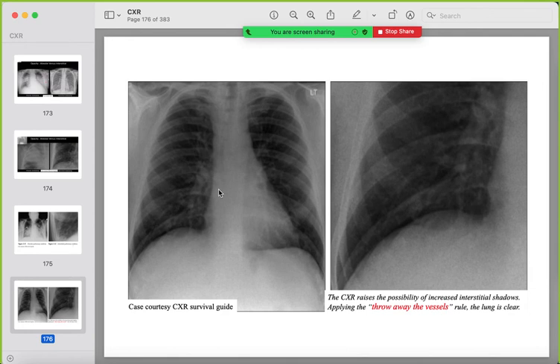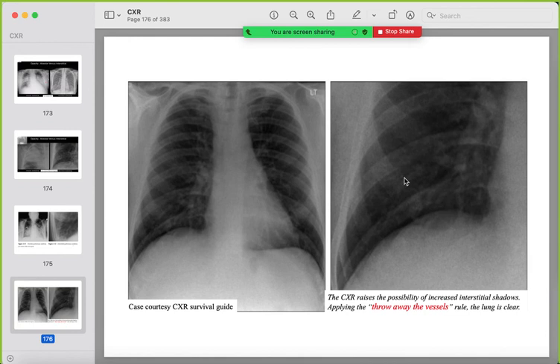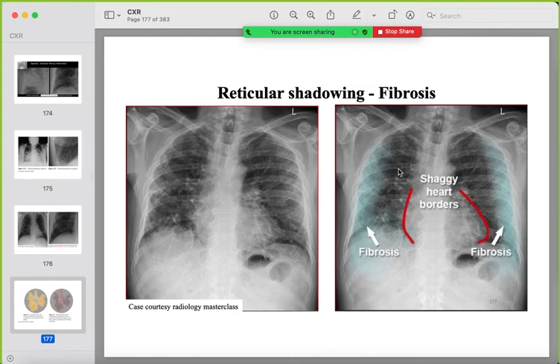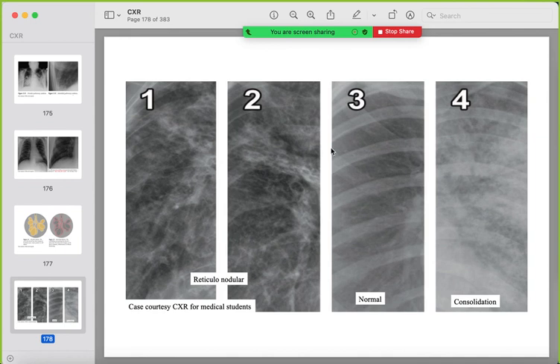A useful technique: if you suspect reticulations, zoom in and trace the vessels. If all the lines are branching vessels, there are no true reticulations. On comparison: normal lung, consolidation with air bronchograms, and reticular/reticulonodular changes of interstitial lung disease have distinct appearances that must be distinguished.